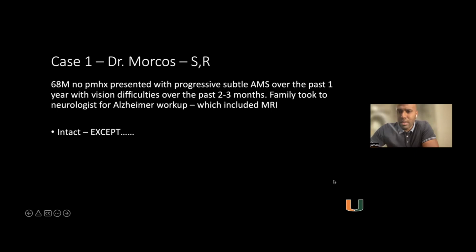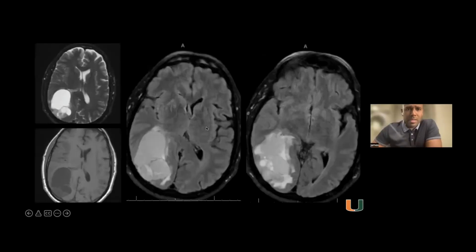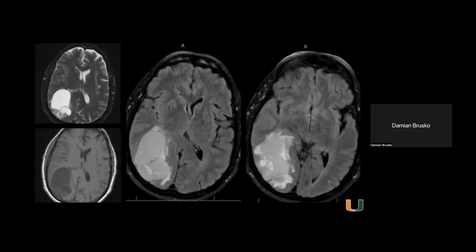So who do we have? Damien, are you available, boss? Yep. All right, fantastic. Here's the MRI. Tell me what you see, what cuts, what sequences, and then after that, tell me what exam finding you would expect.